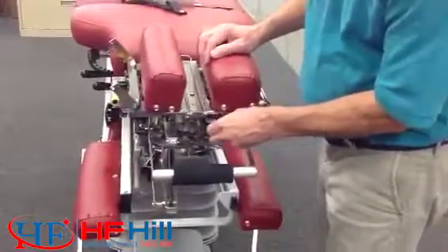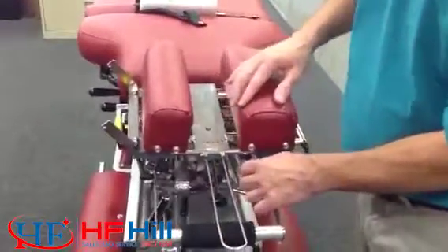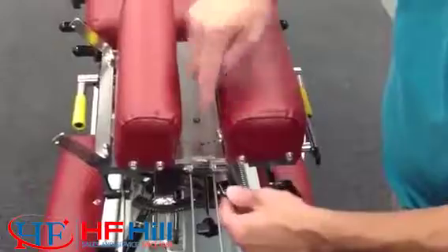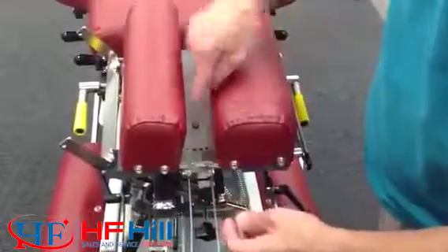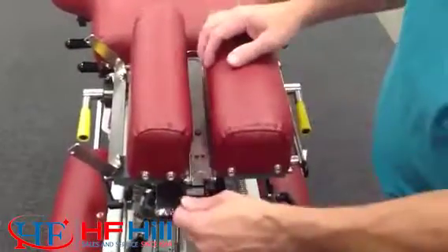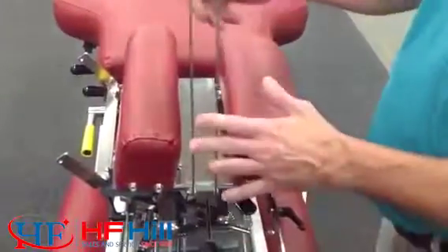The other nice thing is this knob here is a spring-loaded knob, and as you push down on it and move it, you have all these little holes right here on this piece of metal frame, and all you're simply doing is moving this little nipple that's on this spring-loaded lever to a different position. So the cushions will stay nice and tight, and you can get it to a really narrow face structure, or of course a really wide face structure. All about patient comfort here, and plus you have your access for very good cleaning.